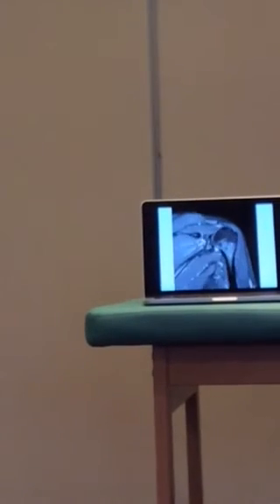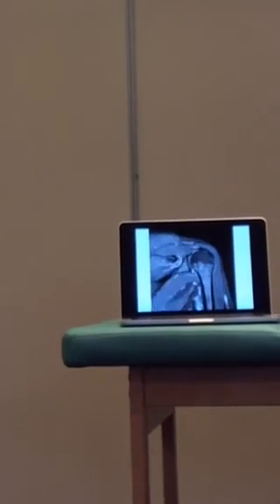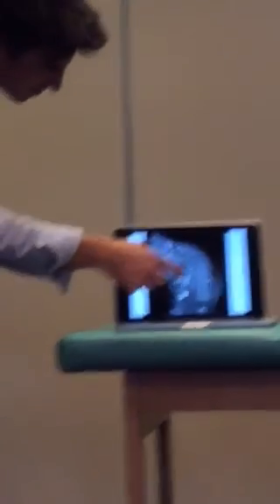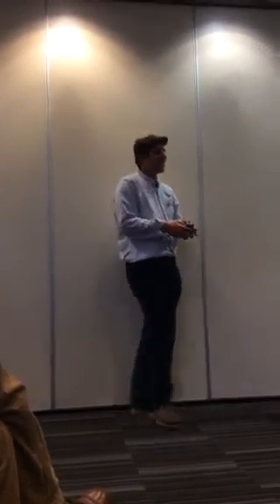MRIs of the shoulder, sorry, I put this in. Somebody with an MRI of a frozen shoulder is likely to be reported as normal, because it is pretty normal. Put rubbish in, get rubbish out. If you don't tell the radiologist there's frozen shoulder, perhaps as a differential, you really shouldn't be sending them for an MRI, to be honest. It looks normal. The only subtle finding is a little bit of increased signal in the inferior capsule. That's it. So MRI is not helpful. Ultrasound is not helpful, because the shoulder doesn't move. For you to see the cuff, you've got to be able to move your shoulder around. That's why ultrasound's helpful, it's dynamic. If you've got a shoulder that doesn't move, you can't see anything.